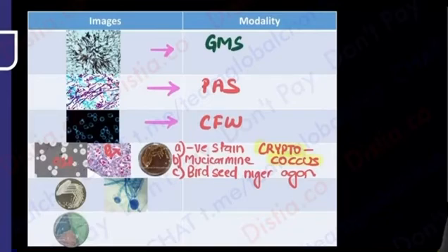Okay, what is the usual agar that we use? So yes, the first picture out here, the first picture is going to be the SDA, right?